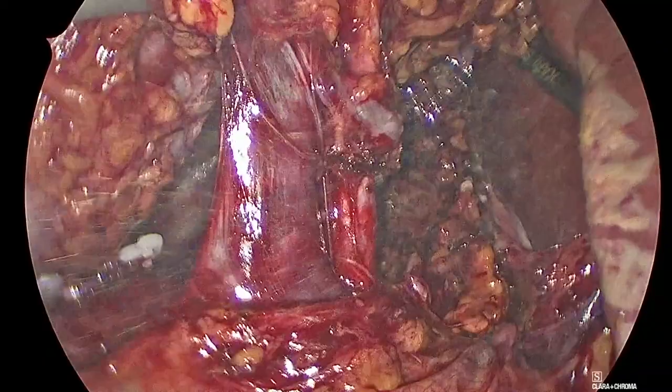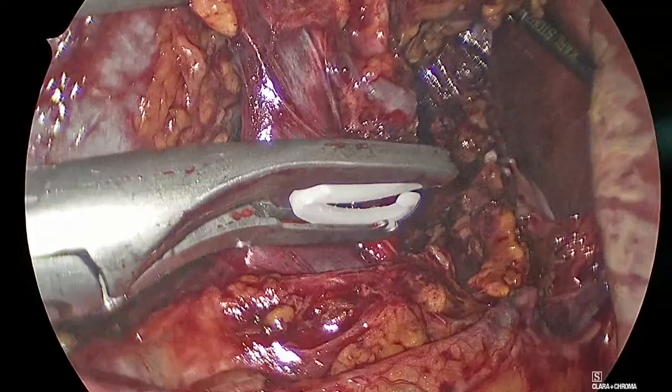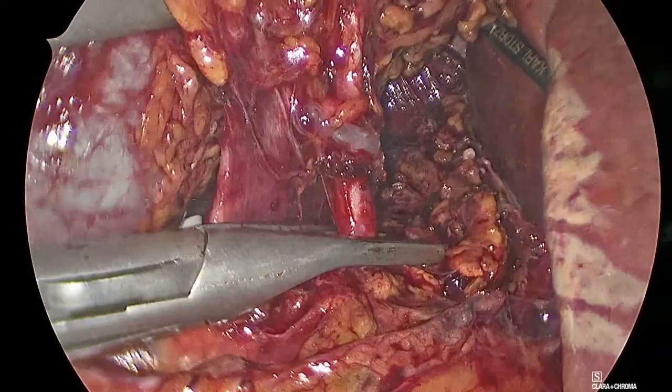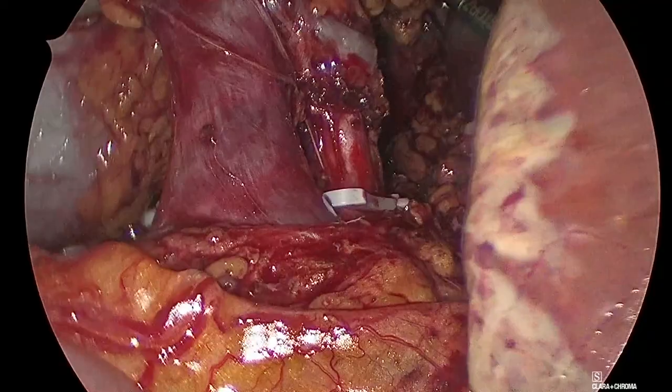Now, this is a little bit of a tricky position of the artery. So one trick is just to stay parallel to the artery. You go in, you open, you rotate, and now you move it down, and boom, the artery is taken. Now, if you have difficulties, oh, come on, somebody has to look at this. Okay, good. Maybe it's me that I have to look at this.